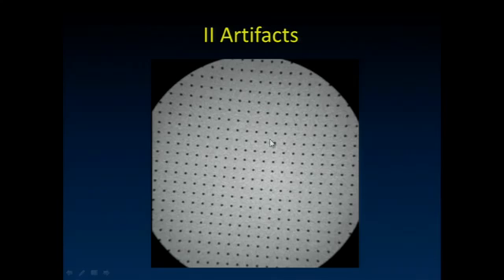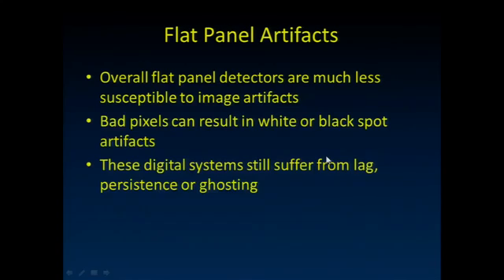We'd also get pincushion artifacts, because the II was really a glass tube like an old CRT, and so its surface had a little curvature. Something which was a parallel grid of holes would look like it had a slight curve, especially at the periphery.